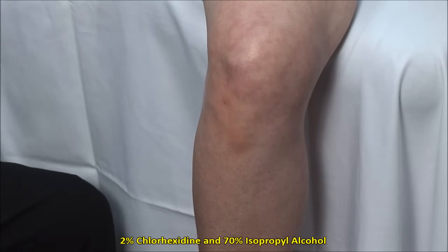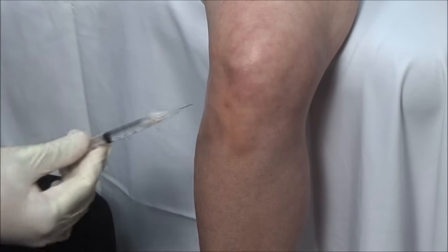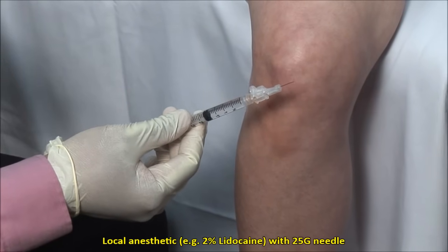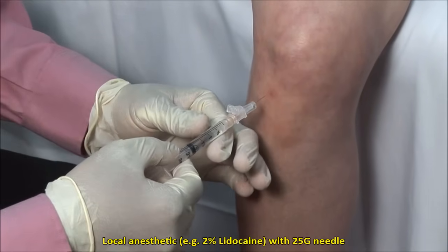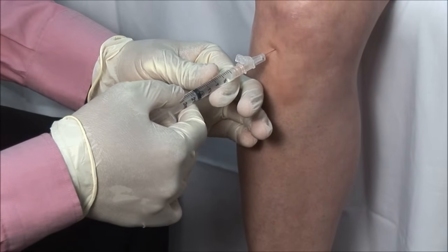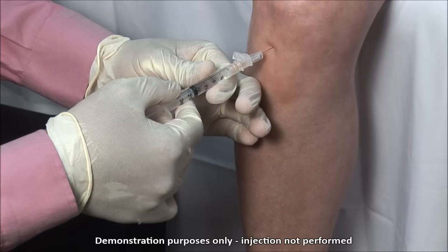Here I am using a mixture of 2% chlorhexidine and 70% isopropyl alcohol. Alternatively, you can use povidone solution followed by alcohol. Local anesthetic can be applied to the skin and subcutaneous tissue down to the joint capsule using a 25-gauge needle, but experienced clinicians may forego this as it is usually a very fast procedure.